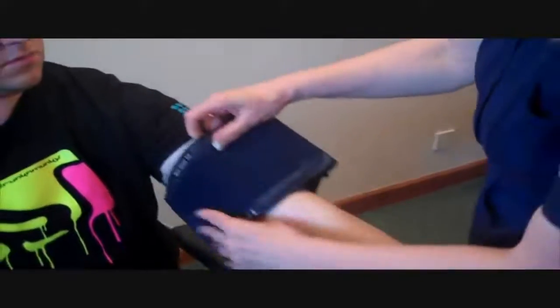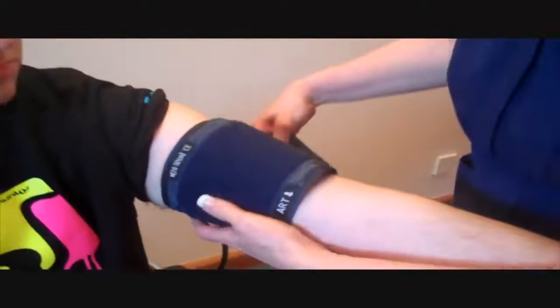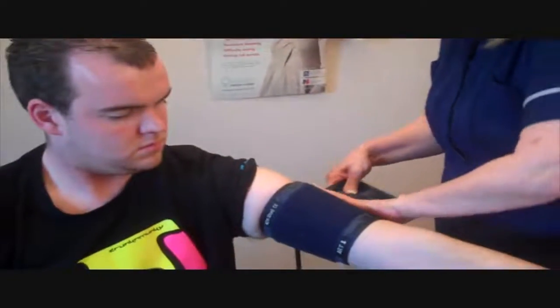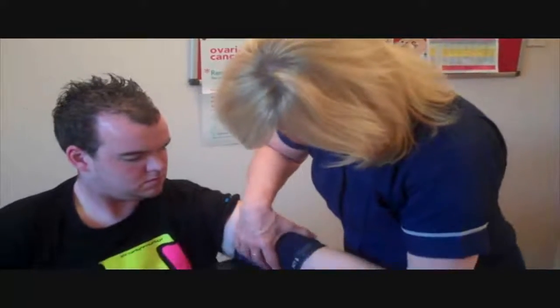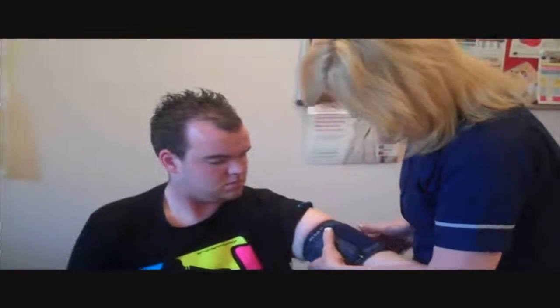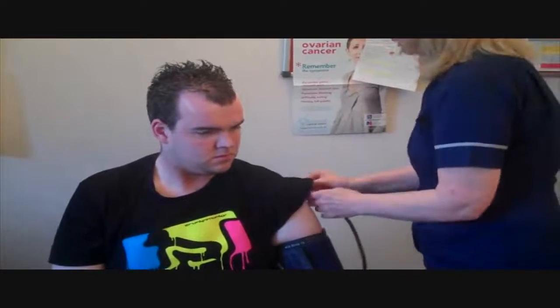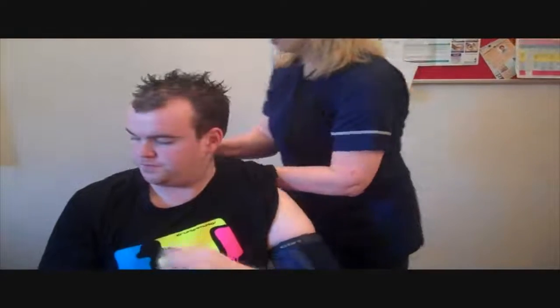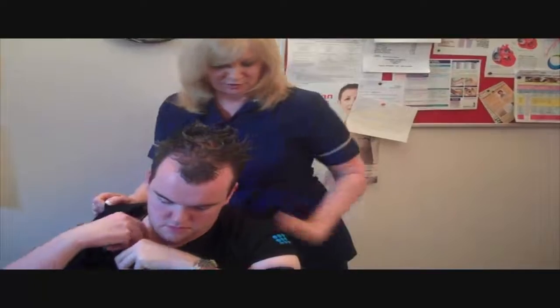And that goes over here. Is that comfortable? I've put it on down there. We'll just feed this through the back of your T-shirt and round to the other side. If you can hold that and bring it down underneath your shirt there.